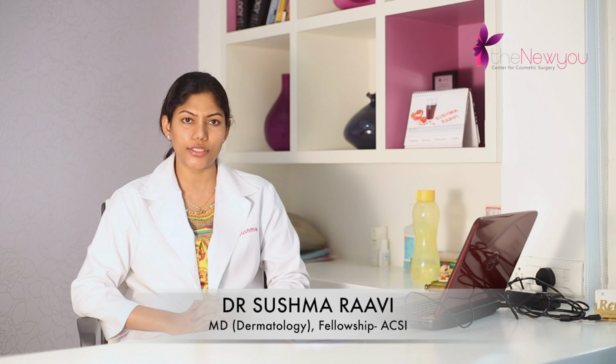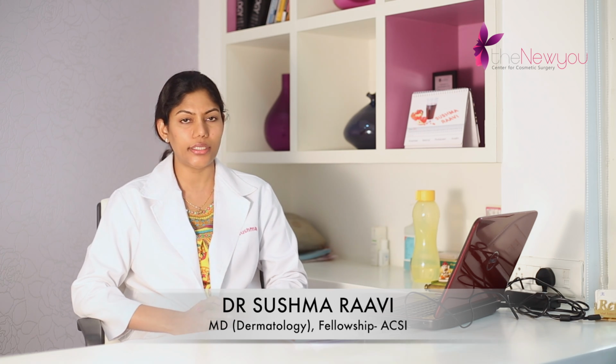Another condition where the fractional CO2 laser helps is acne scars. Acne is a very common problem, like 90% of the boys and 80% of the girls have had pimples any time during their lifetime. In most people, it is very mild and it just leaves brown spots and fades away. But in a few it can be devastating. It can leave depressions and scars on the face. And these scars stay back for a lifetime. So fractional CO2 laser can improve these scars.